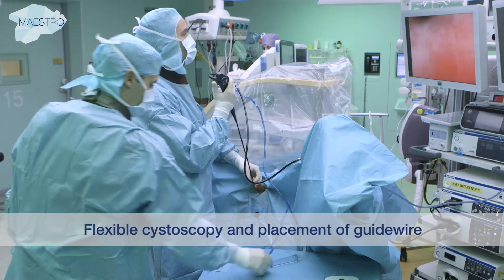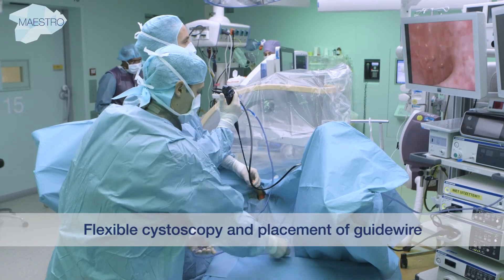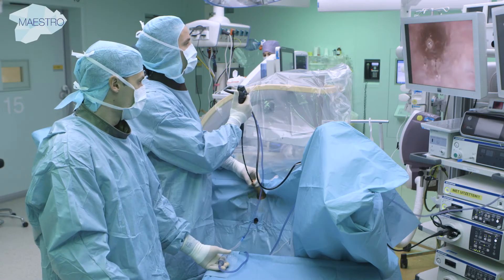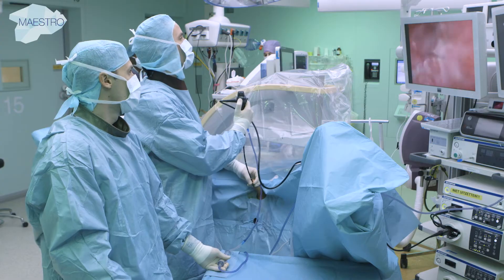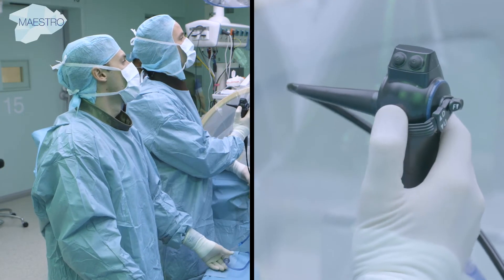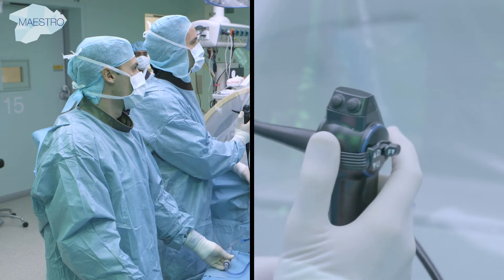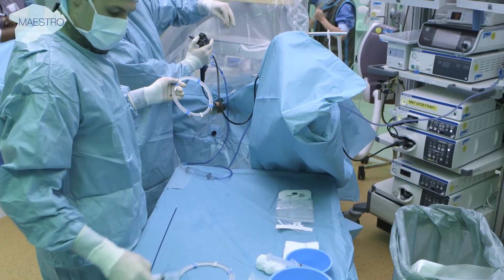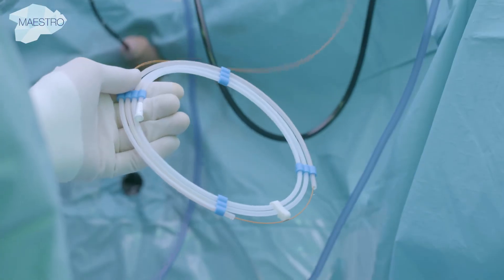The cystoscopy is performed using a digital flexible cystoscope. The ureteral orifice is located and a guide wire is passed through the working channel of the cystoscope and placed inside the ureter under fluoroscopic guidance.